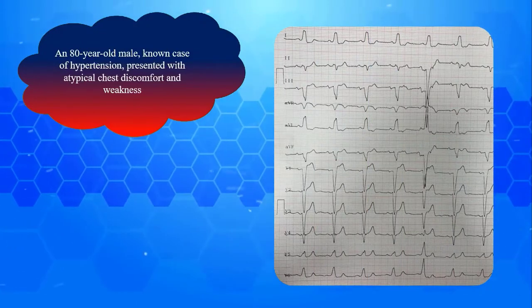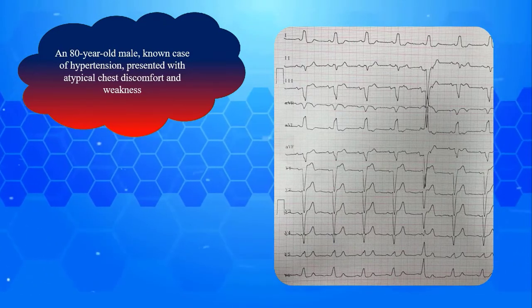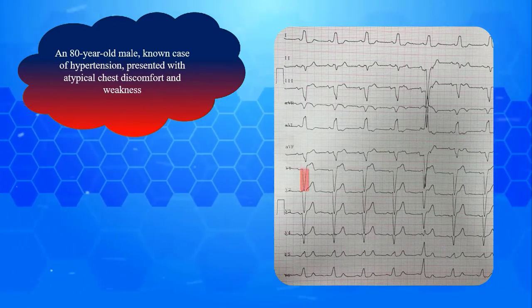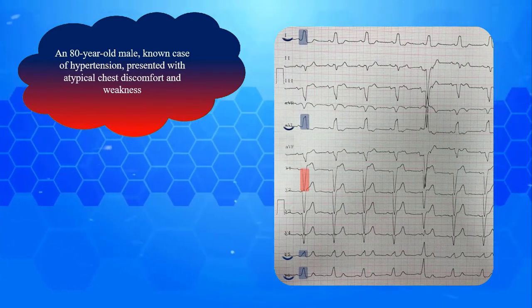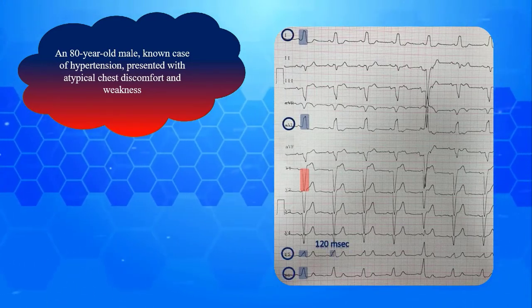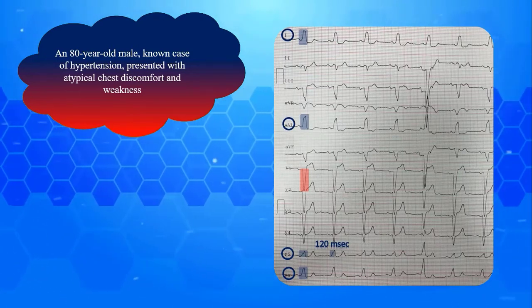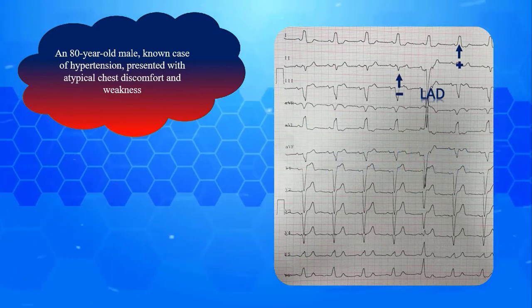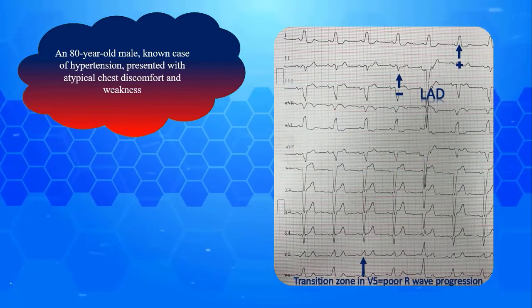Our first EKG belongs to an 80-year-old male, a known case of hypertension, presented with atypical chest discomfort and weakness. On physical examination he is tachycardic. The QRS complexes are broad with deep S wave in V1 and tall slurred R wave laterally. No septal Q wave is observed in lateral leads. R peak time in lateral leads is obviously prolonged at about 120 milliseconds. Therefore this is a typical LBBB. Other associated findings are left axis deviation, poor R wave progression, and occasional secondary STT wave changes.